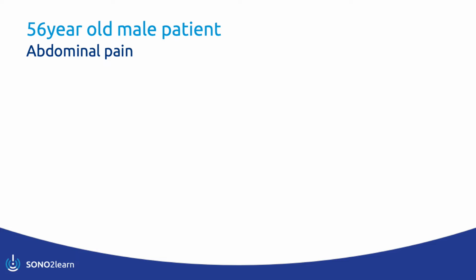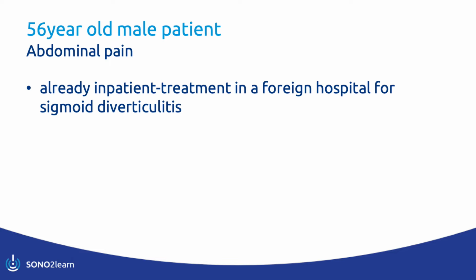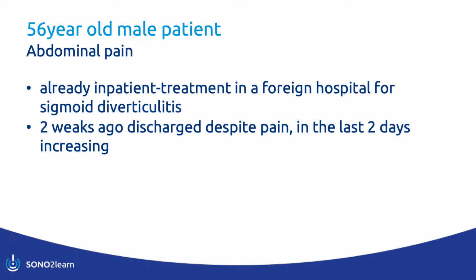Night is not only for sleeping. A 56-year-old patient presents with abdominal pain. He has already received inpatient treatment for sigmoid diverticulitis. Two weeks ago, he was discharged despite the pain, which has increased significantly again in the last 2 days.